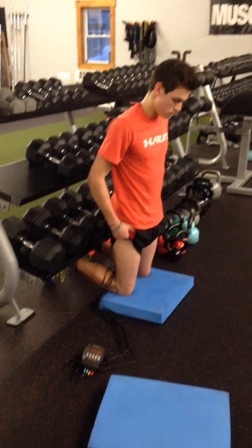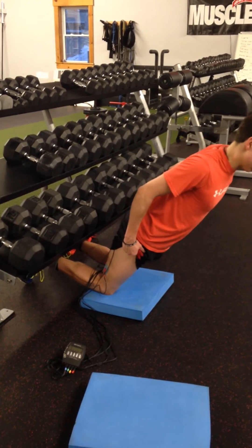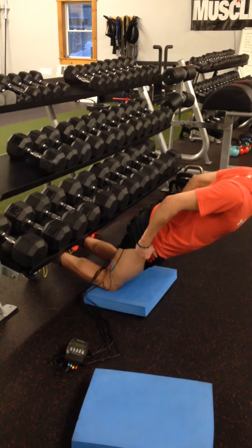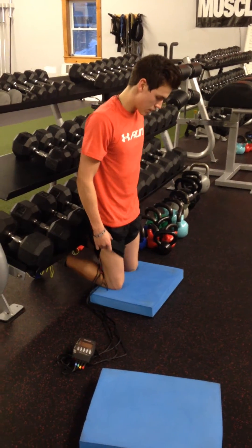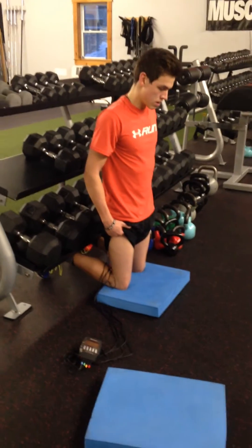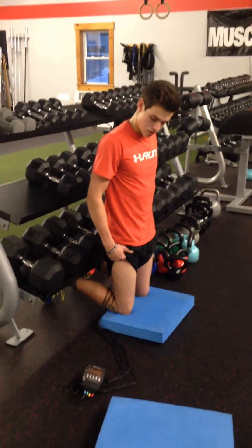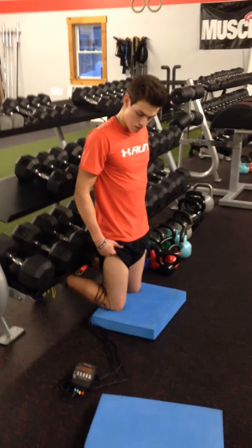He's doing a Nordic hamstring eccentric movement here, and we've got the Compacts hooked up on his hamstrings in a strength setting, so he's got about a four-second contraction and he's resisting on the way down during the contraction.